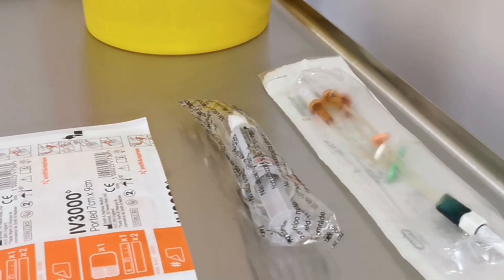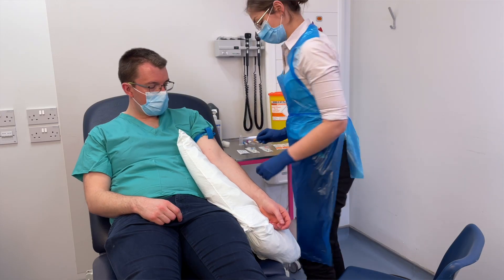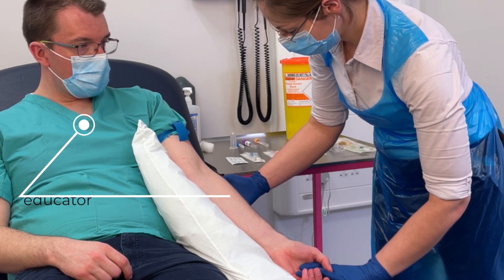Gather your equipment and check you've got everything before you start. Introduce yourself to the patient, explain what you want to do and gain their consent. Next put a tourniquet around the patient's arm and have a good look at different sites for a really good vein. Once you're happy with the vein and you can feel it, clean that site with an alcohol swab as per your hospital protocol, wait for that to dry, and open your cannula.